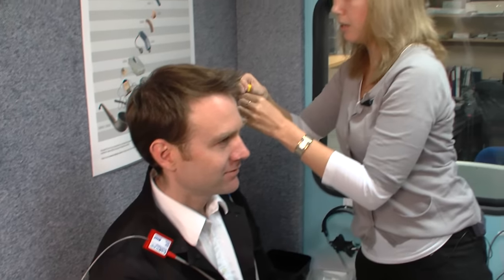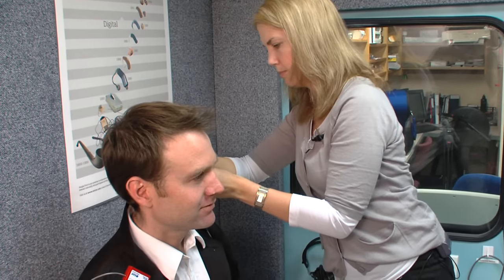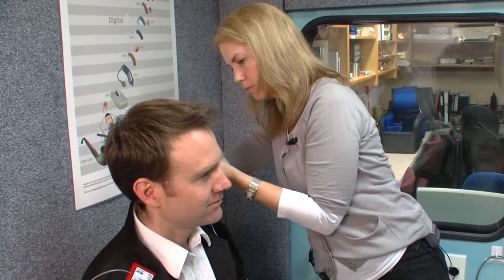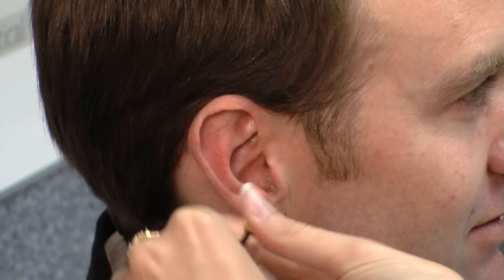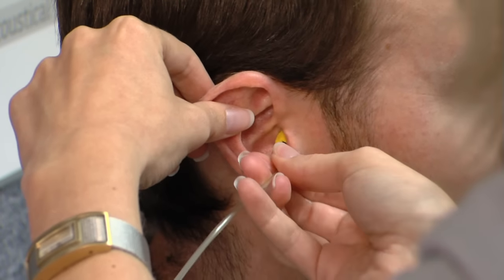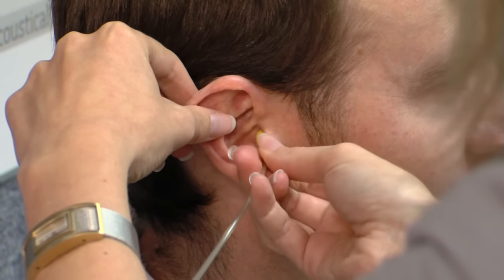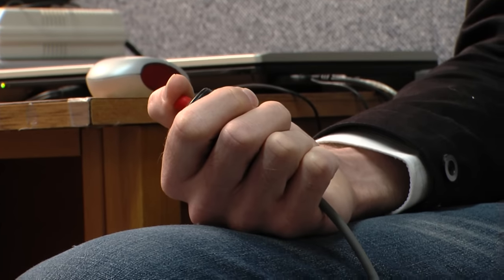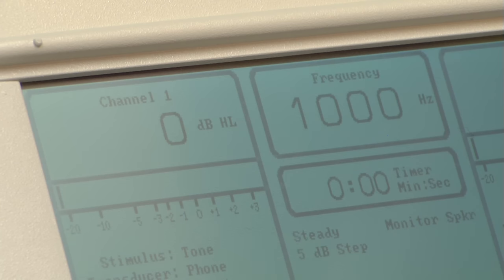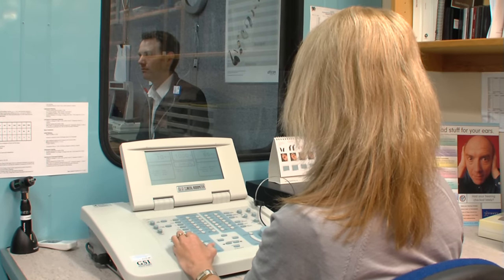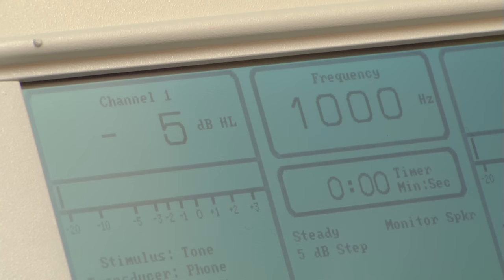So it just sort of goes in your ear like a foam ear plug. The procedure for establishing an audiogram from an adult client begins with air conduction testing using pure tone stimuli. Headphones, or these insert earphones, are used to deliver the stimuli to the client's ears, one at a time. The client responds to the sounds they hear, usually by pushing a response button. The tests establish the patient's threshold of hearing for each of a number of frequencies that are important for understanding speech.